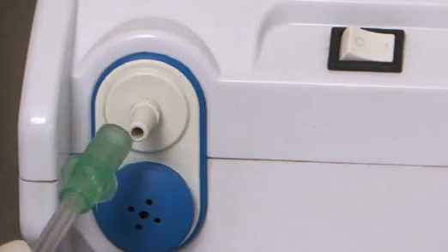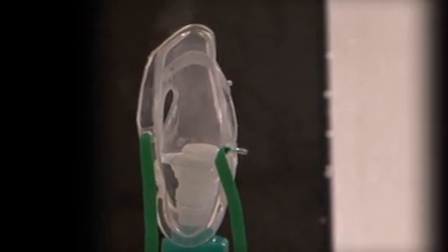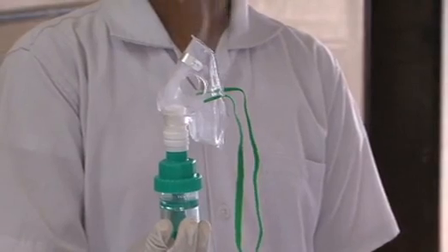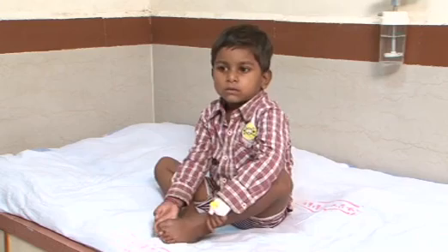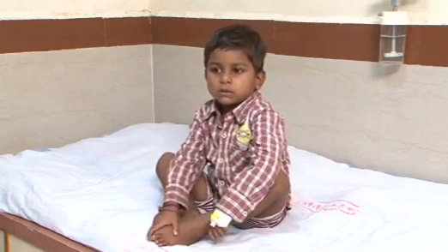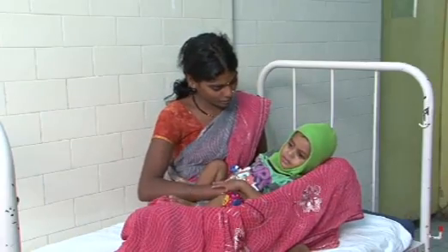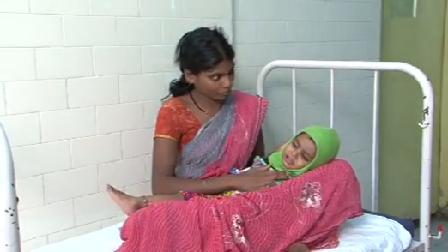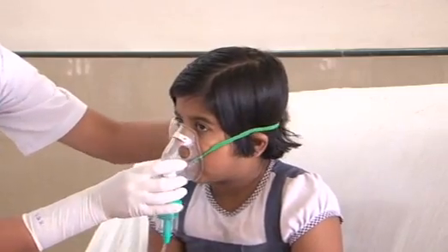Connect the nebulizer tubing to the port on the compressor. Turn the compressor on and check nebulizer for misting. Hold the nebulizer in upright position to avoid spillage. The infant or child should preferably be in the most comfortable position, kept upright or semi-inclined in the mother's lap. If using a face mask, ensure that it is well-fitting.